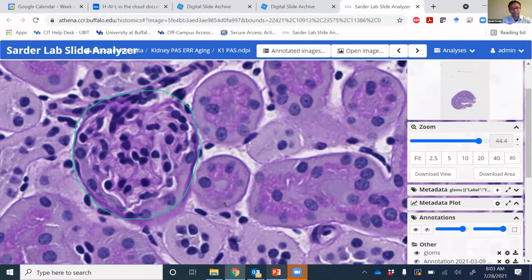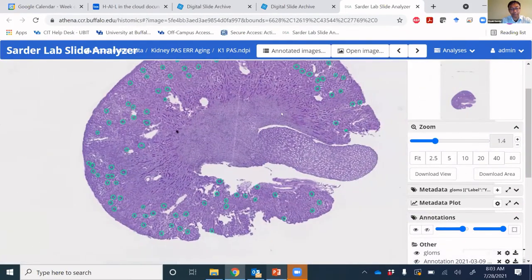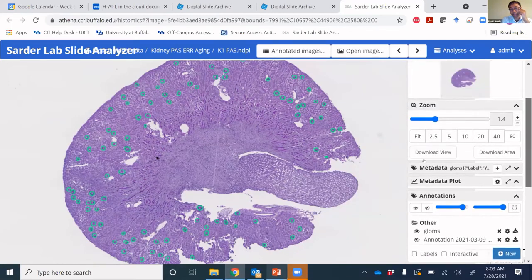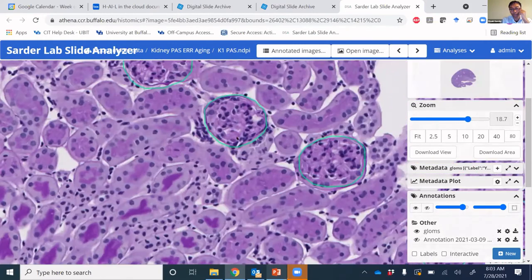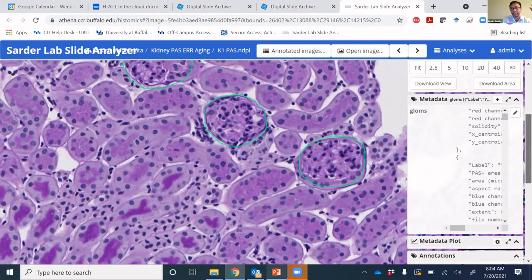So here, the mouse image I was showing, the way we are developing this system, and we are still moving, is we are really trying to address the FAIR principles of data use. Once you segment, we are able to quantify deep features from this image. Deep features means how big this glomerulus is, how many nuclei are there, how much texture there is, or different types of features.